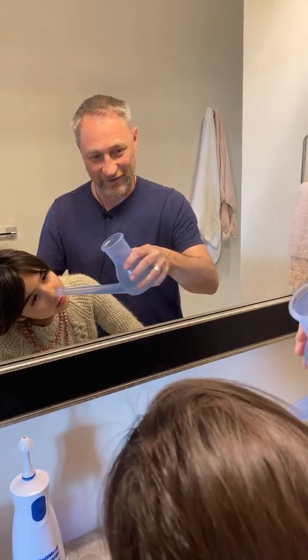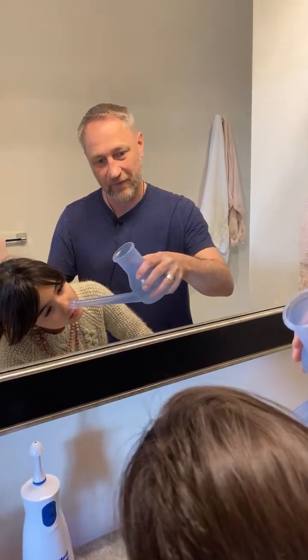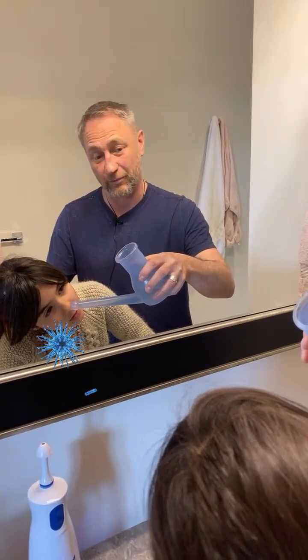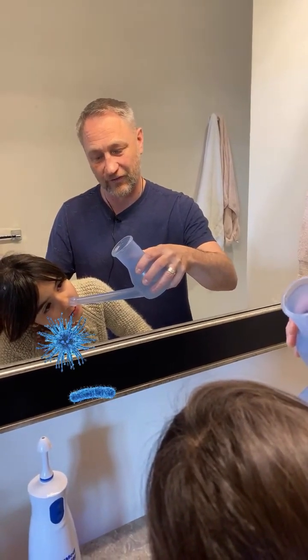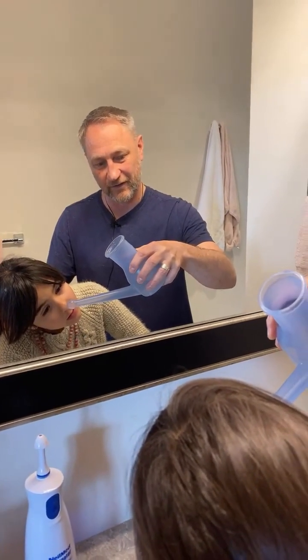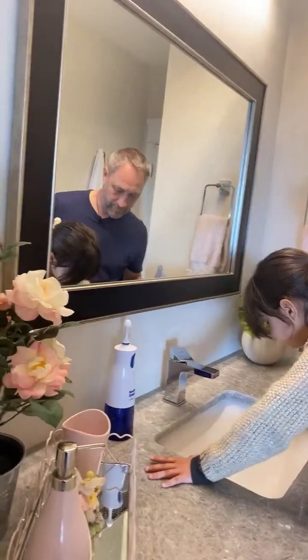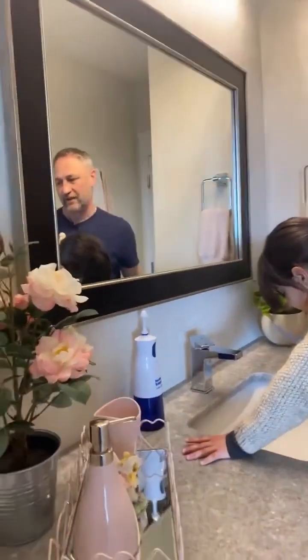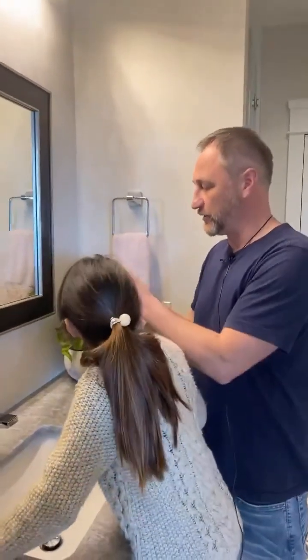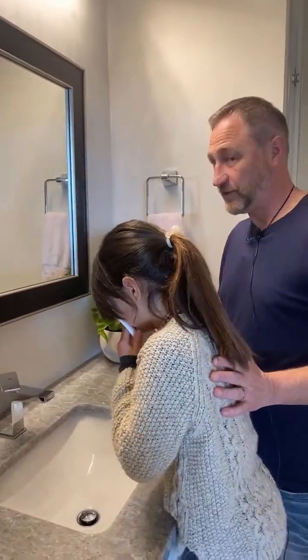If it drips down towards their chin and chest, just have them tilt forward a little bit more. Sometimes you'll find little bits of mucus popping out — we call those snot slugs, so we look for those. Sophie's got a couple little things there, nothing crazy. Let it drain out, then pass her some tissue so she can blow her nose. A lot of times kids like to give a gentle blow in between — not too hard — and then we'll do the other side.